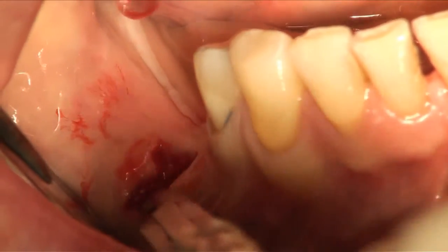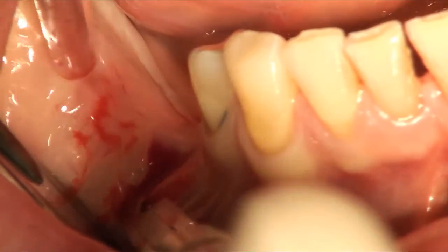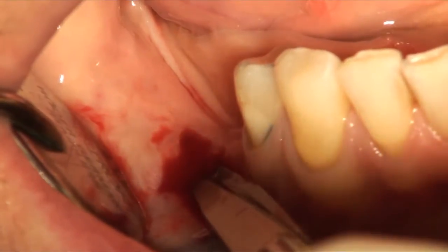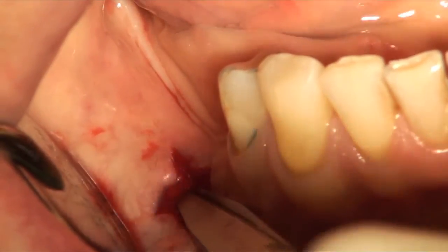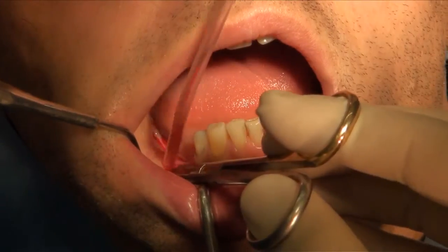And still we do not cut the periosteum. Then we start with a blunt dissection of the pouch using the scissors.